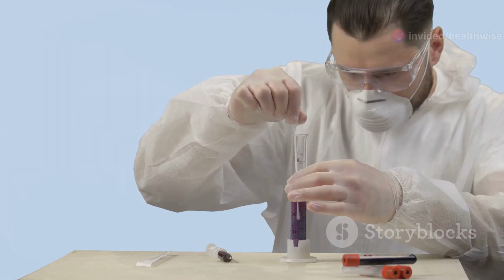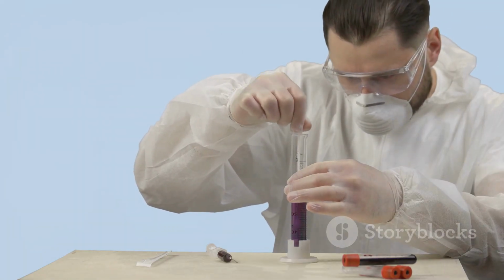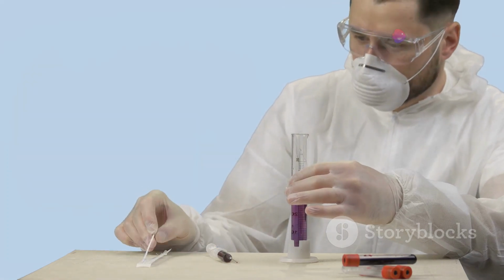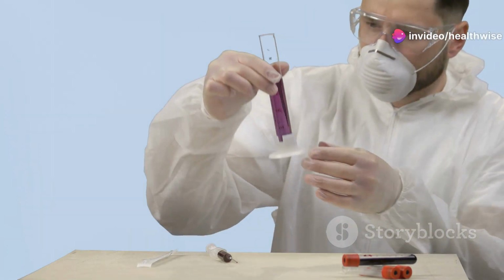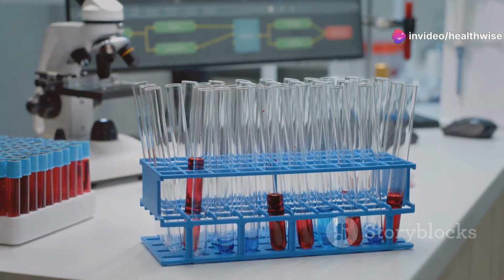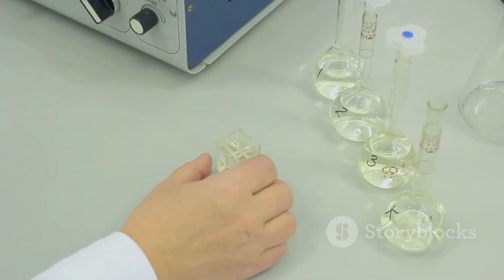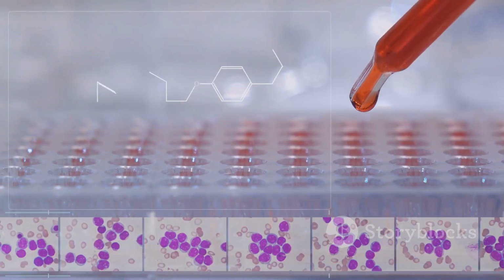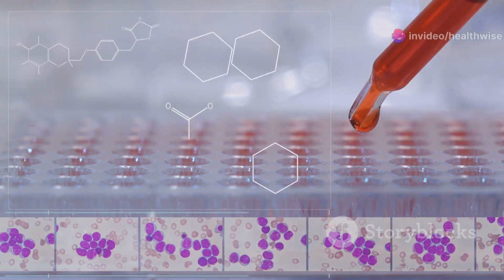up to 3 months. For the procedure, take 3 milliliters of your prepared reagent and add 50 microliters of your sample, standard and control to separate tubes. Mix well and let them sit at 25 to 35 degrees Celsius for 15 minutes. Set your spectrophotometer to 0 with a blank sample at 600 nanometers. Then measure the absorbance of your standards, test, and control.